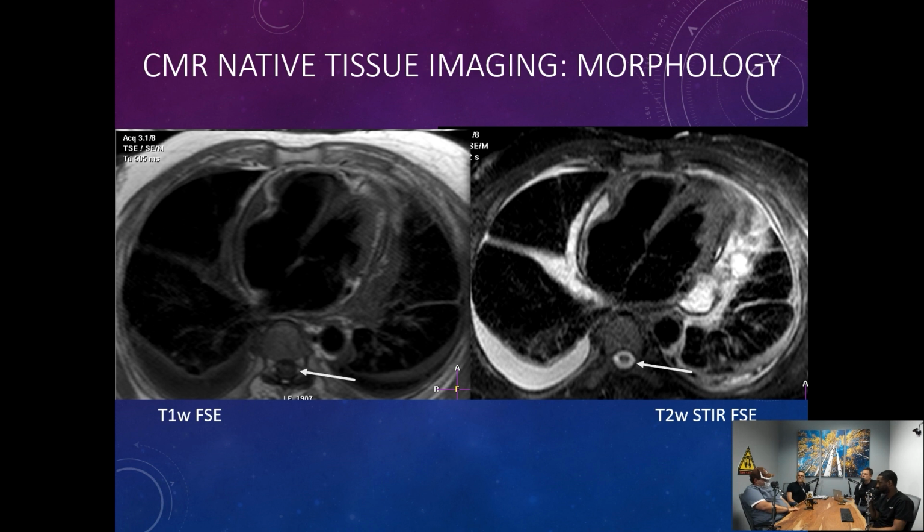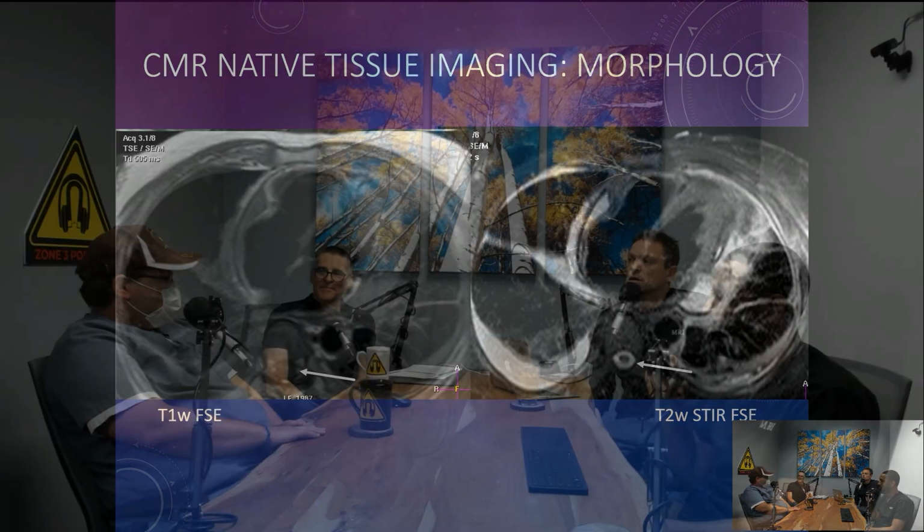Well, I will say, speaking as somebody who is involved in operations and has to keep an eye on time on the scanner, for cardiac CT, the slower the better. So if we could stop people's heart and do a CT, it'd be great. We'd have trouble getting the contrast to go into the coronary arteries probably, and the patient probably wouldn't be too happy about that. That's the advantage of MRI. Yeah. You don't require as slow.